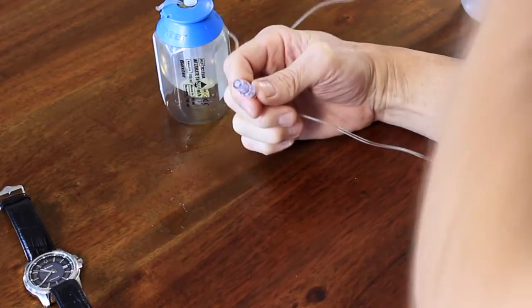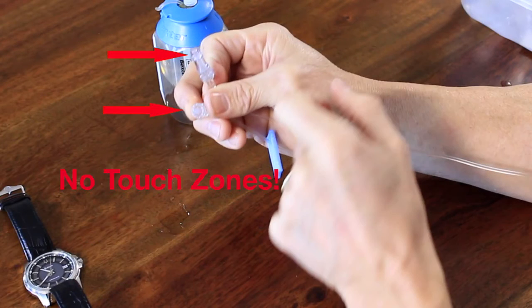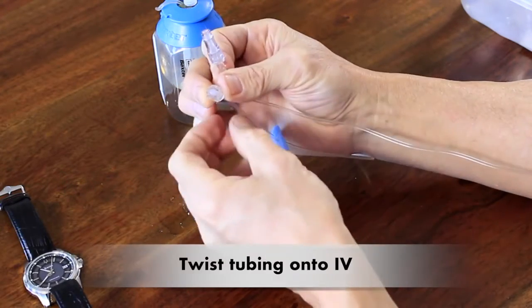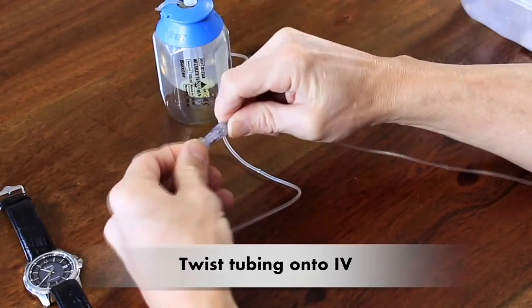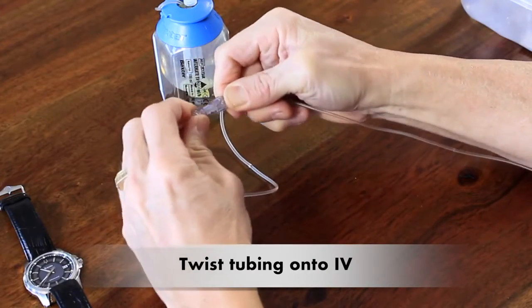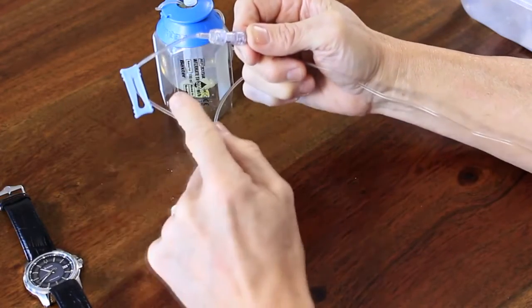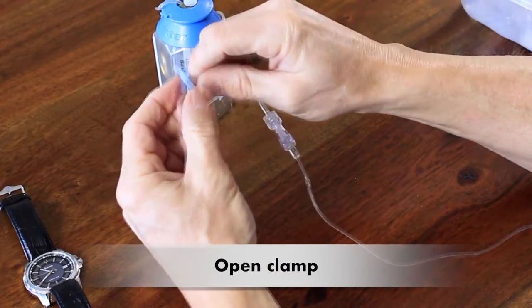Take the cap off the tubing. Now that open tip of the tubing becomes a no-touch zone too, and you need to attach the two together. You're going to push and twist the end of the tubing onto your IV cap. Push the slide clamp forward so that it's open and the fluid can start to flow. The fluid will automatically start flowing.